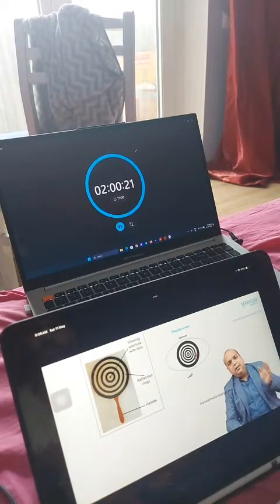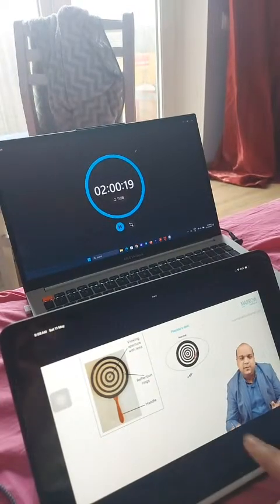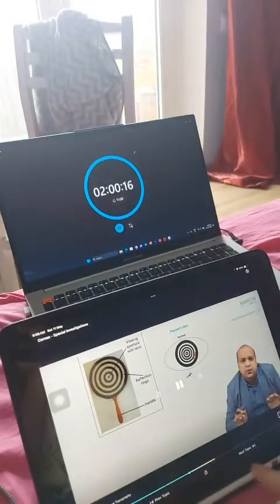For example, if there is an undulation in this ring, that this ring goes like this, then we would have known that there is an undulation in this part of the cornea, that there is an ulcer, there is some pathology in this part of the cornea. That is how simple a placido disc is to affect it.